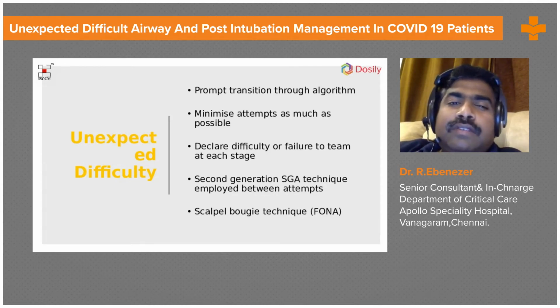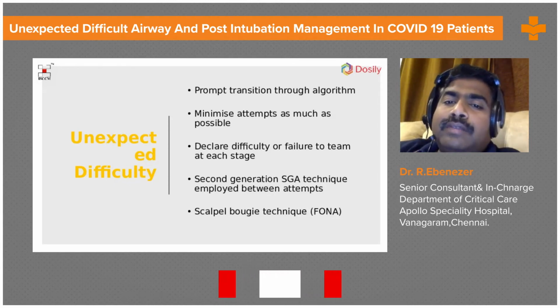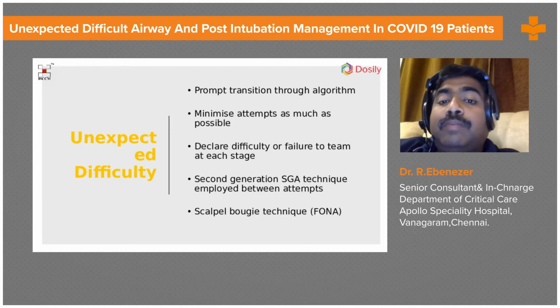See, first and foremost, quickly you have to do the intubation, because every second, every minute you stay there, there is a potential hazard to the healthcare professional. At the same time, there will be occasions when there will be difficulty to be faced. That is where a senior person at that particular junction knows exactly what to do. He has traveled through these situations many times in his life. Simple adjustments, simple things, he will be able to get the job done much better than a junior person at that time. So there are no egos, nothing here.